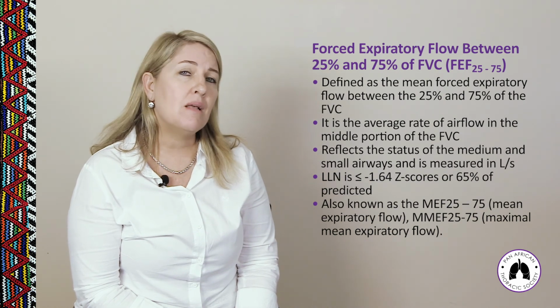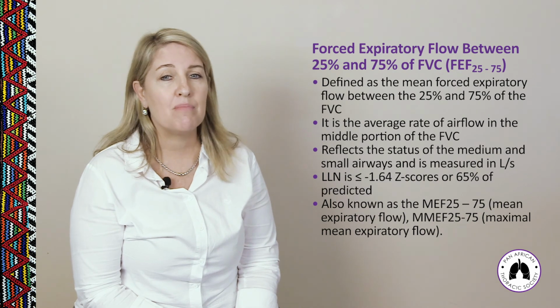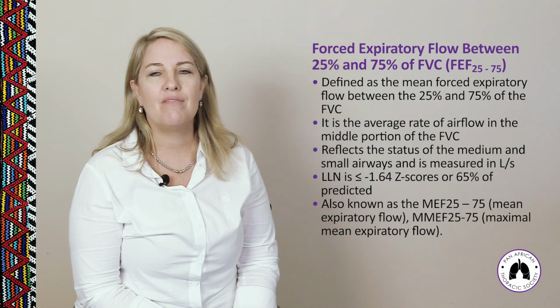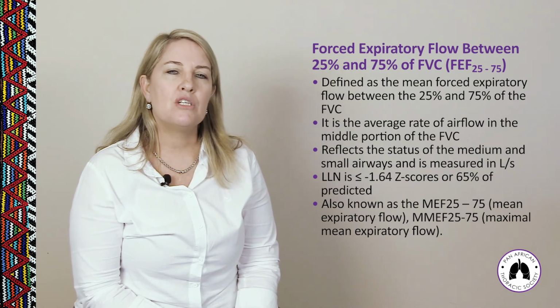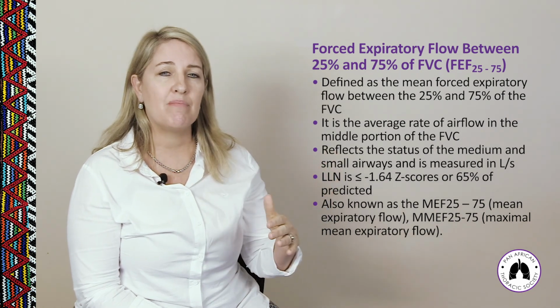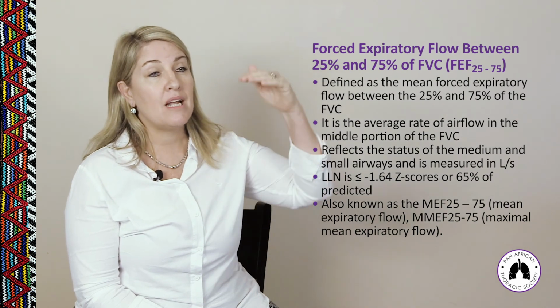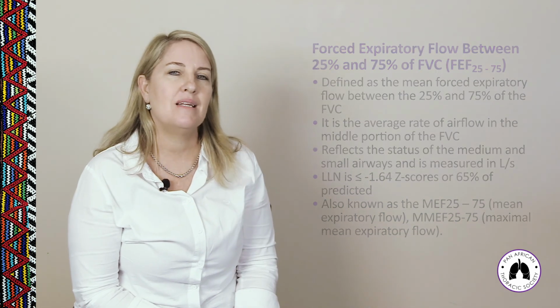This particular measurement can also be known as the MEF 25 to 75% or the MMEF 25 to 75%. So in some spirometers, this will measure the FEF 25, then 50, then 75%. And in other spirometers, it's the MEF, which is measured at 75%, 50%, and 25%.